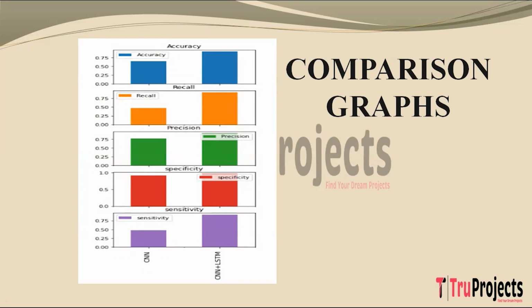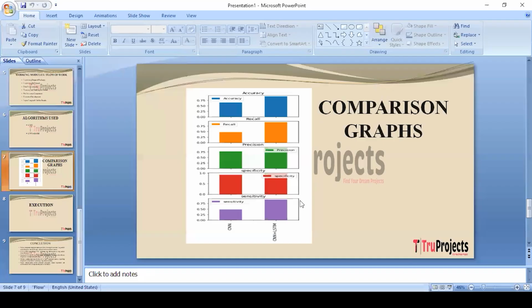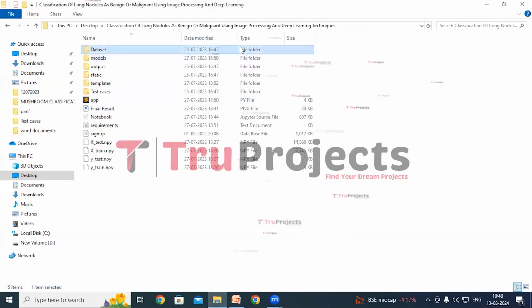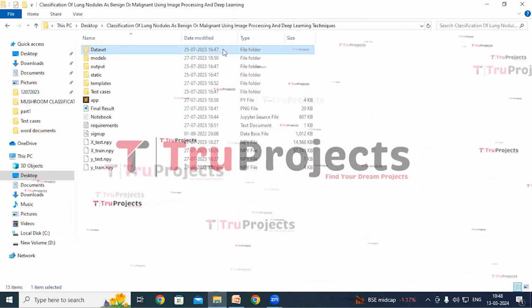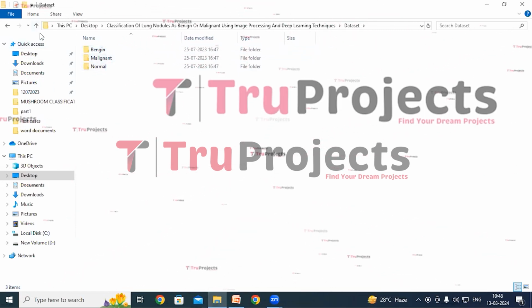So, the algorithm which is best performing in all the performance metrics will be used for classifications, and we can see the CNN plus LSTM model is doing well. Execution of the project. To execute this project, first we need to open the code folder which contains the project source code files. So this is dataset folder in which I have required radiological images on which will train the models. So I have three different classes of images: benign, malignant and normal.